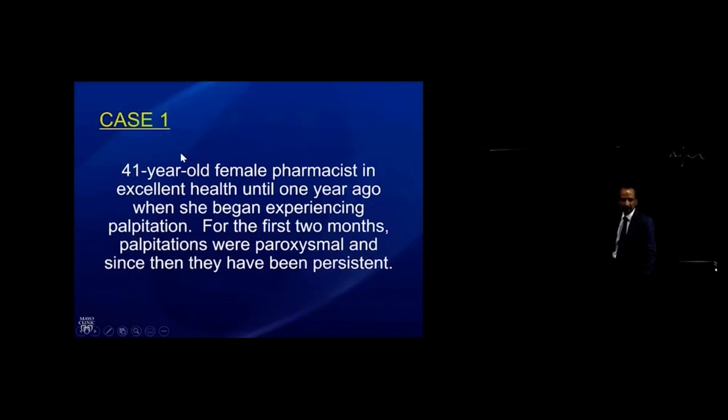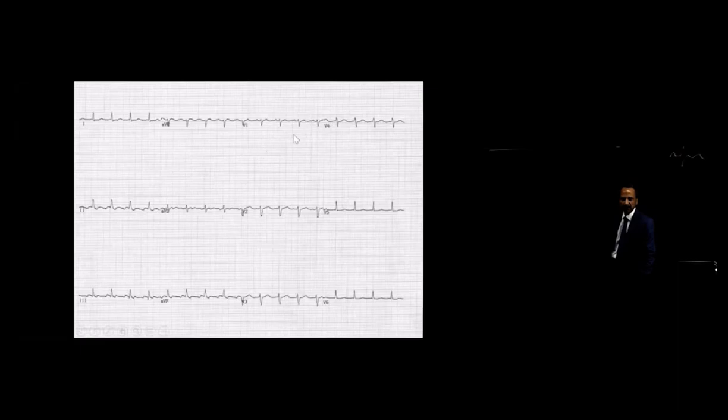Just a case, this is one of my own from a while ago that illustrates approach for when it's not going. Young person, no structural disease, but already on a fourth ablation for typical flutter. This is the index ECG when patient was seen in the emergency room.